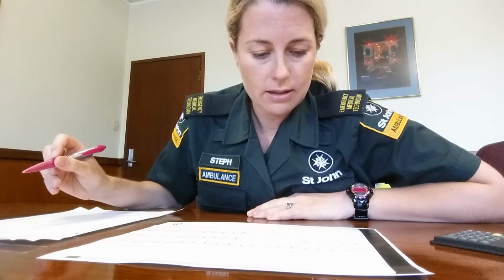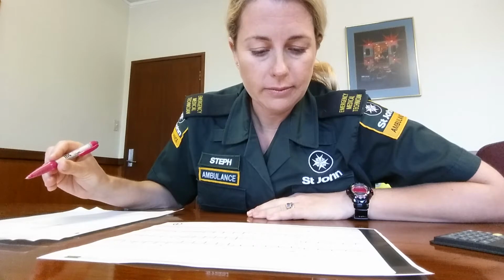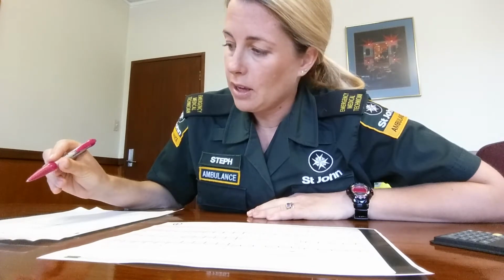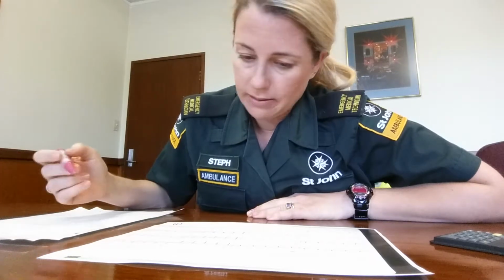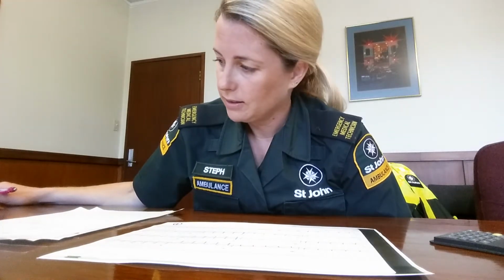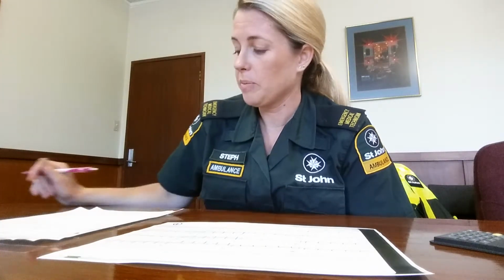And in V4R, you see 2 millimeters of ST segment elevation. And he's a 56-year-old male, so you'd need more than 2 mm of elevation in V2 and V3, which you've got. So, yeah, inferior posterior STEMI.